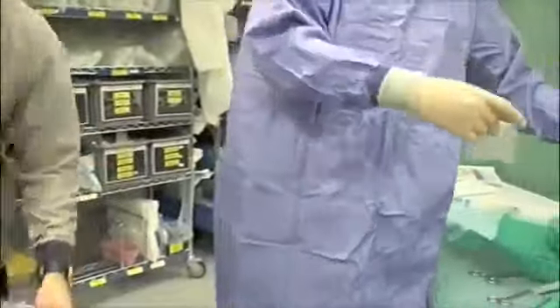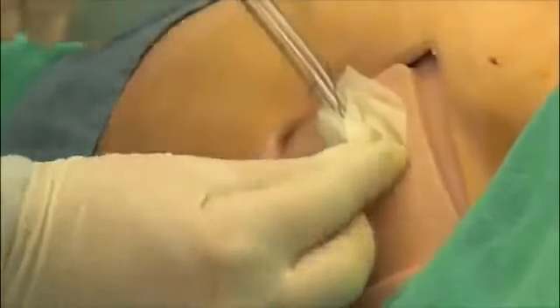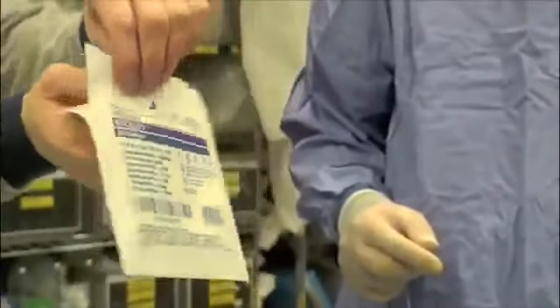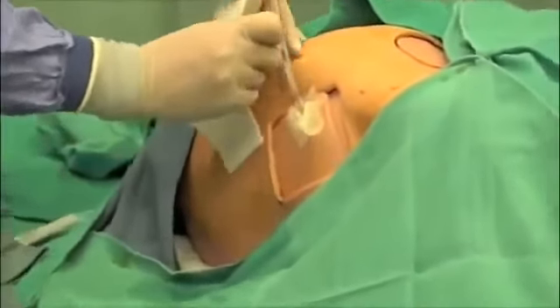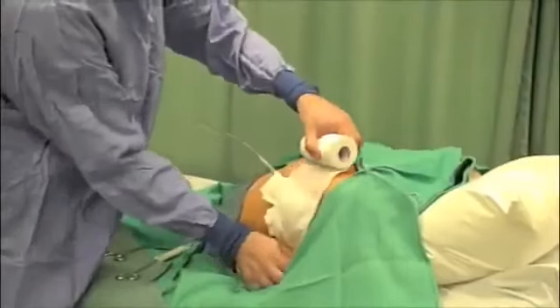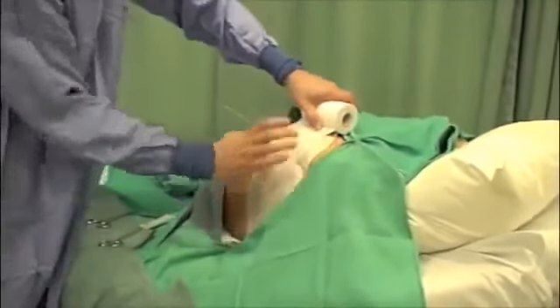Apply an occlusive dressing such as adaptic and drain sponges. Secure with Mefix. Tape the tube to the chest. A flexi-track may be used.